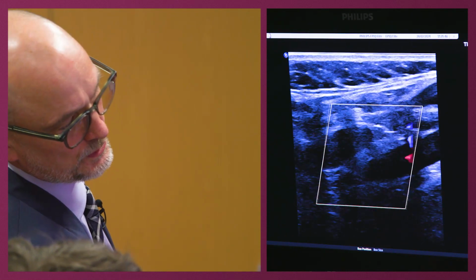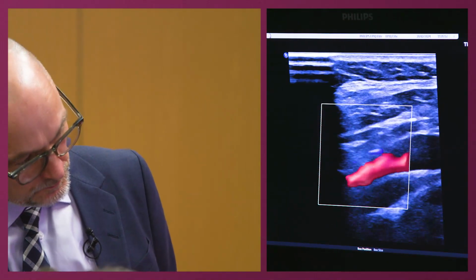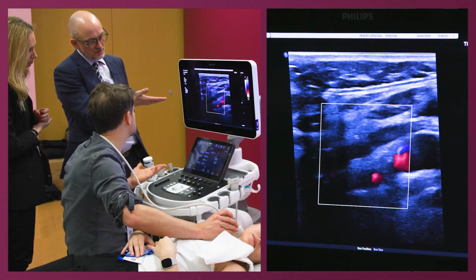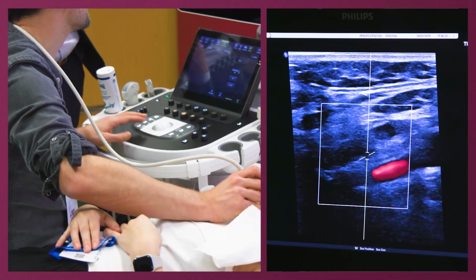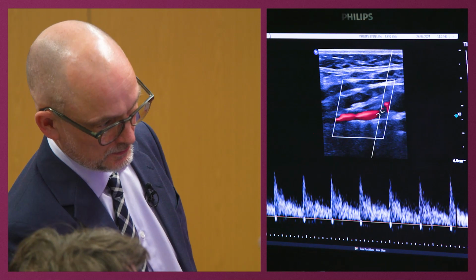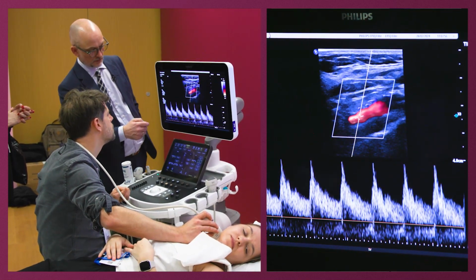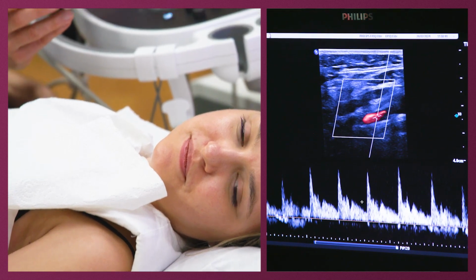My experience is that sometimes, when I do lower limb, I have it like this. But when I come to the bifurcation, I like to have it a little bit more perpendicular to the flow. It's not a problem in this image, the 60 degree. If you go very parallel, then you simply lose some of the contrast in the image. But it's difficult to see a side branch actually. You cannot see them. No, I agree. Should we try to see the color flow curve? Maybe that would help. It's a little bit suspicious that you have this, if it should go to the brain. That could be, but look at the other one. Wait a second. Here. This is a brain signal. Agree? Yes. So let's try to find the other one you showed us before. Then you should mark the image.